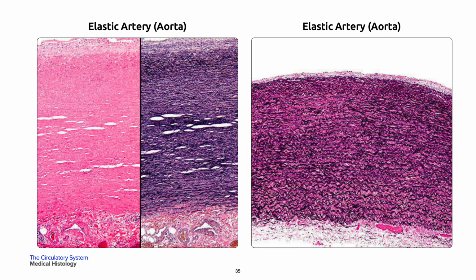On your left is a photomicrograph comparing the H&E and elastic staining of the aortic wall. Note the relatively thin intima layer. Nearly the entire thickness of the wall is comprised of media with alternating elastic fiber and intervening smooth muscle layers. The adventitia is also prominent with a large vasa vasorum readily apparent. On your right is a normal aortic wall which is composed of multi-layered strata of wavy elastic fibers.